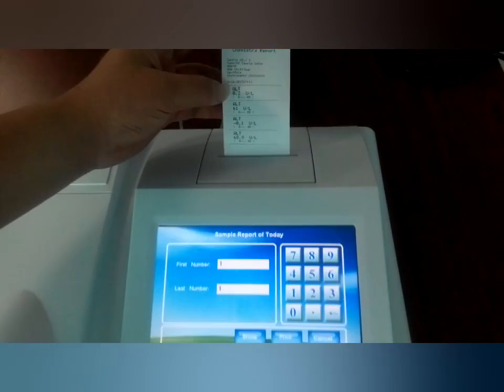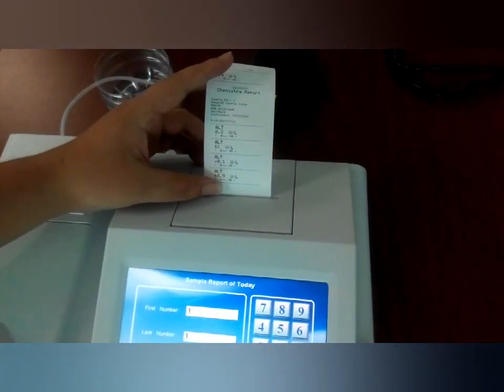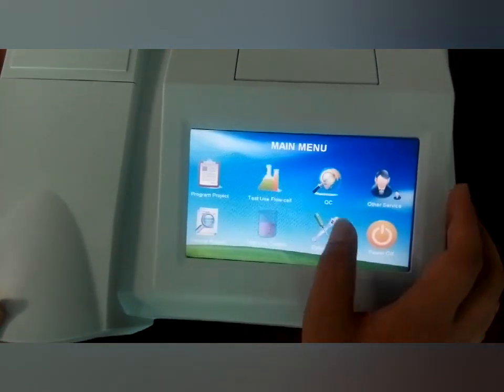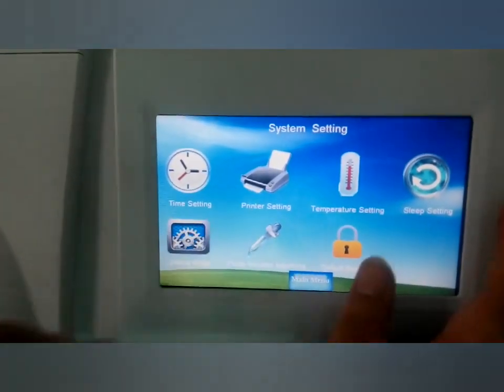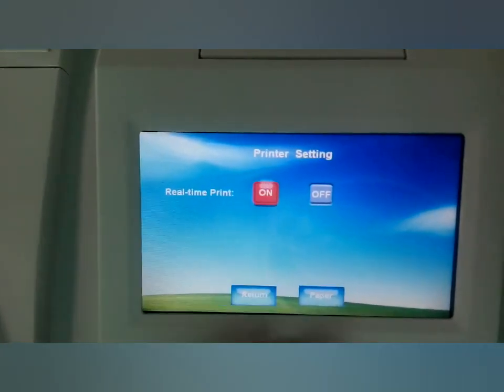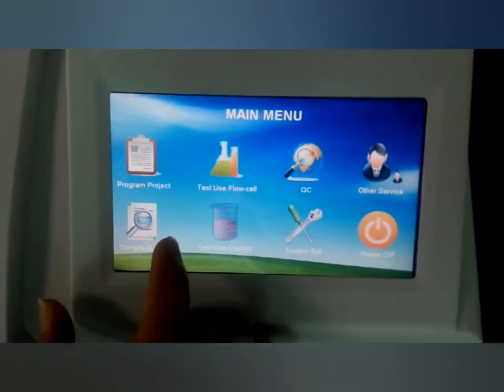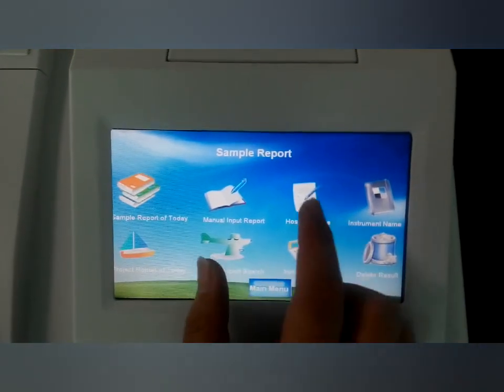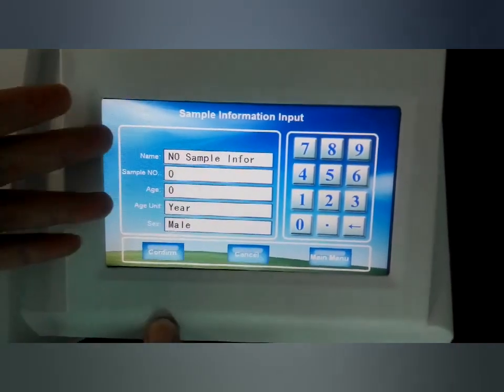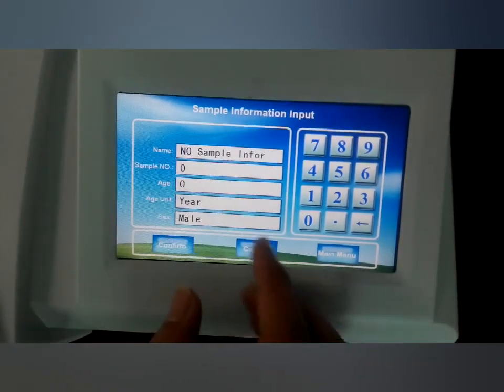If we want to get printed results, we can go to system service and printer settings — just choose 'on' and return to the main menu, and that will be okay. From the sample report, we can also put in the hospital name, patient name, sample number, age, and sex of the patient — it is all from here.